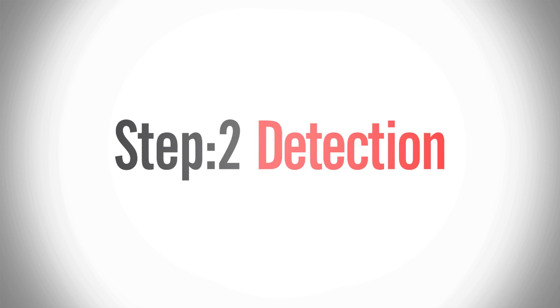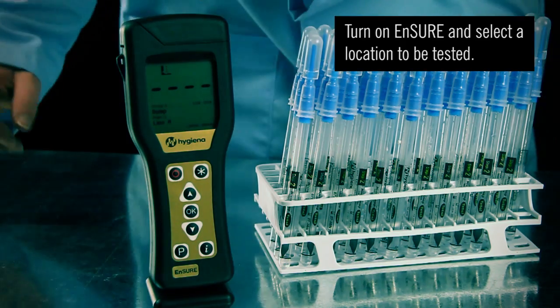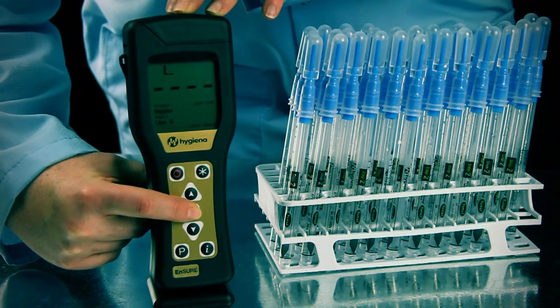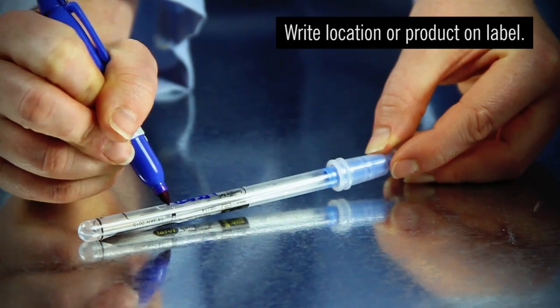The second step is detection. Allow the detection device to acclimate to room temperature before testing begins. Turn on the Ensure luminometer. If you program locations, select the location to be tested. Write the location or product on the swab tube label for easy identification.